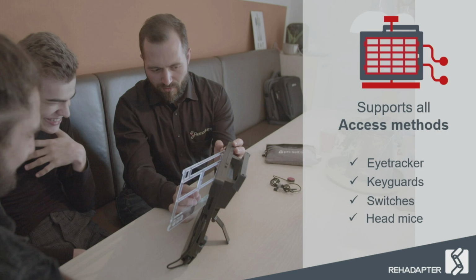And in the same way, you also get it in. You just hold it against the screen, push it in on one side, and click the keyguard inside, which makes it super easy. You don't need any additional Velcro or tape or anything else to fixate the keyguards here.